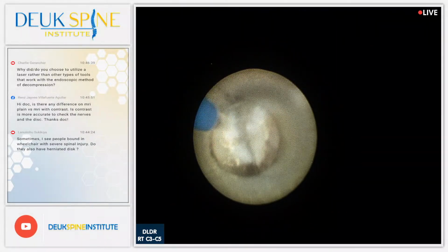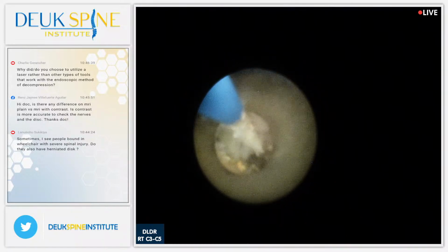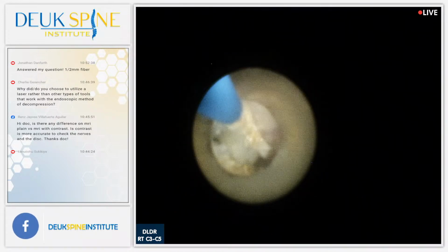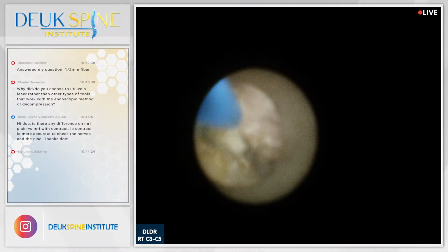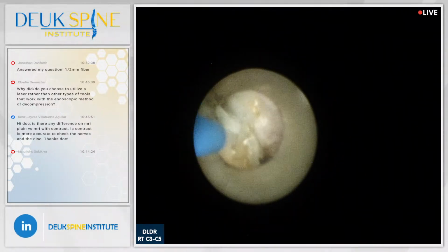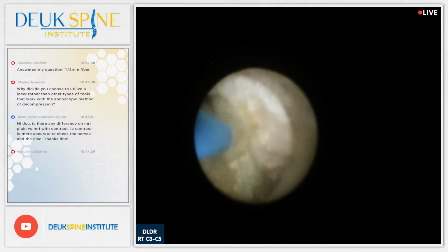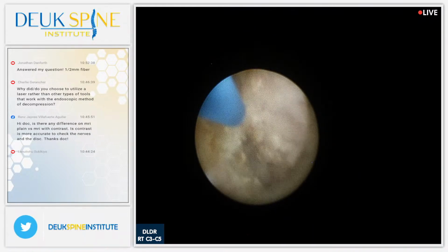We have another question I'll take, coming from Charlie on YouTube. Yes, Charlie, happy to take your question. Welcome to our live stream. Asking why did and or do you choose to utilize a laser rather than other types of tools that work with the endoscopic method of decompression? Charlie, other tools do not work with the endoscopic method of decompression. I'm not sure where you get your information. But the laser fiber here is half a millimeter, or 0.5 millimeter. There is no other tool that works as well as the laser or even takes the place of a laser.